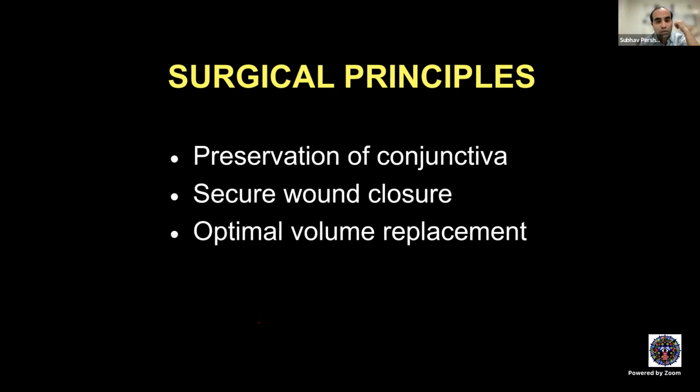With the implant, we have about 2/3 of the volume replacement, and the rest is covered up by the ocular prosthesis. Okay, so generally, the prosthesis needs about 30% of the volume, right? So 70% of the volume is replaced by the implant and 30% is left for the ocular prosthesis. So about 4.9 cc is the maximum volume of the implant and 2.1 cc is the maximum volume of the prosthesis.